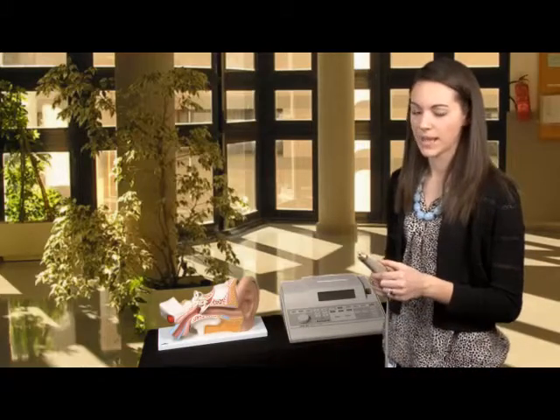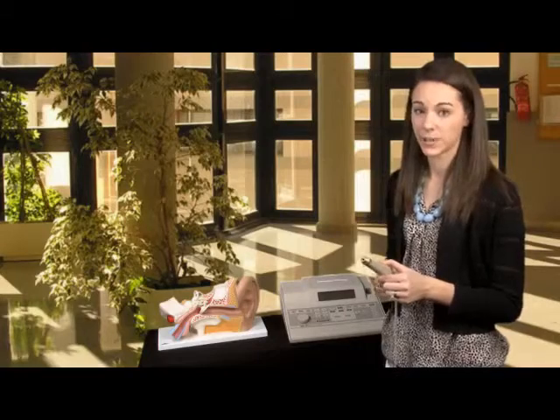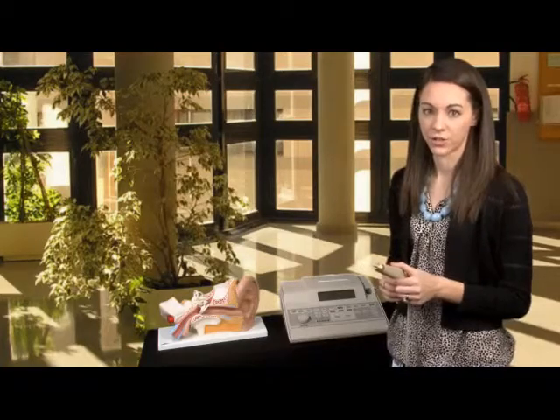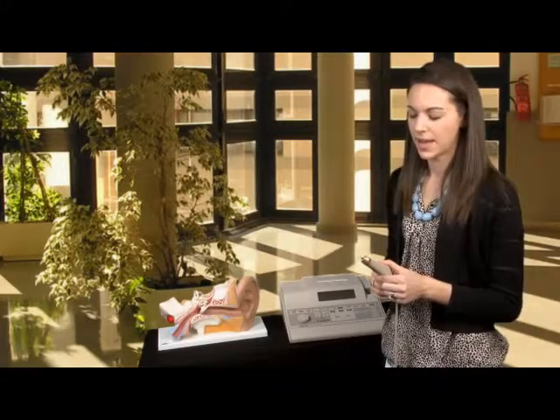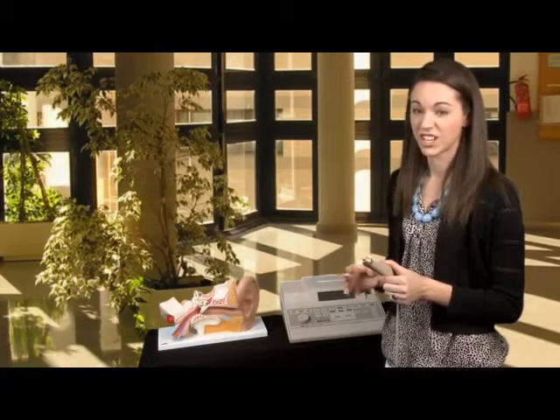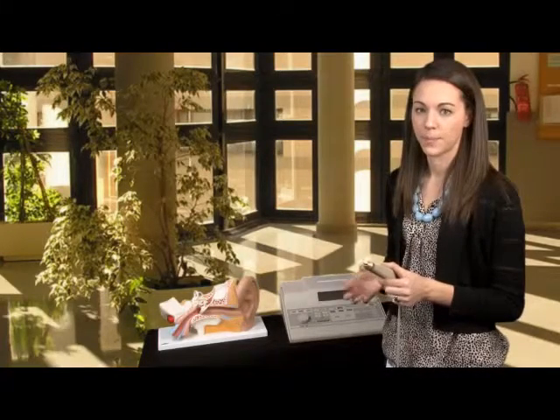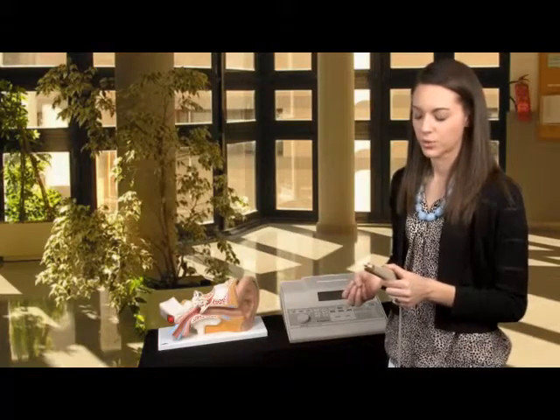The probe has several different parts. It has a loudspeaker that emits a low-frequency probe tone into the external auditory canal. It also has an air pressure manometer that can change the air pressure in the external auditory canal. And it also has a microphone that picks up that low-frequency probe tone from the external auditory canal.